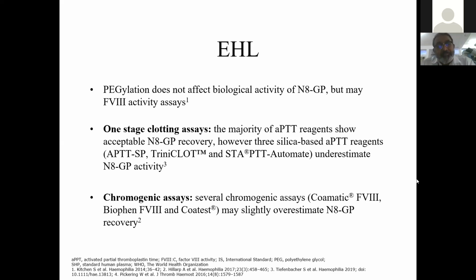Now, though pegylation does not affect the biological activity of one of these products, N8GP, it may affect the factor 8 activity assay. So let's look at the one-stage clotting assay. The majority of the APTT reagents show acceptable recovery of this factor extended half-life product. However, 3 silica-based APTT reagents, which are particulate contact activators, underestimate the N8GP factor 8 activity.